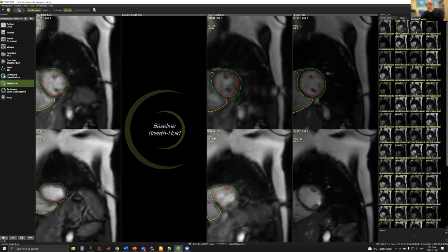So what you're saying is that the end of the hyperventilation, still present in terms of the metabolic state during the initial phase of the breath hold, is then already reliable. And what about the free breathing? Do you think that we're comfortable enough to use these values? In some cases, yes. I don't think this particular data set would be good. You'll see that they're severely distorted. But in some acquisitions, our current artifact removal system is good enough to clean those up. But it seems to be kind of patient specific and acquisition specific.